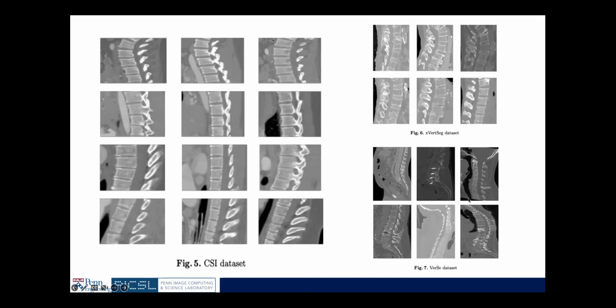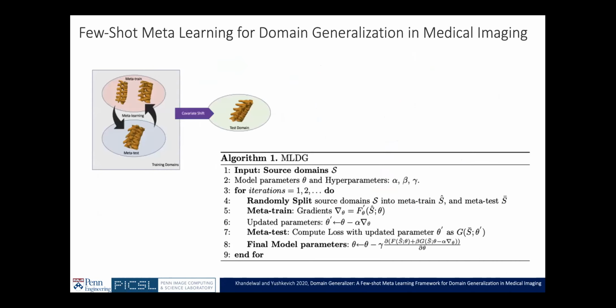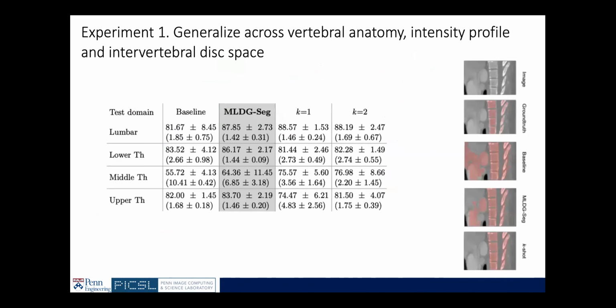And again, there is another data set where you have possibly everything that you can imagine in the vertebrae segmentation data set, coming from a distant distribution of low and high dose CT, implants in the vertebrae, major dislocation and fractures, right? So I'll give you just qualitative examples of what kind of different experiments can be done with domain generalization. You can skip looking at the table and the figures. I'll just tell you how the experiments are designed in these settings.